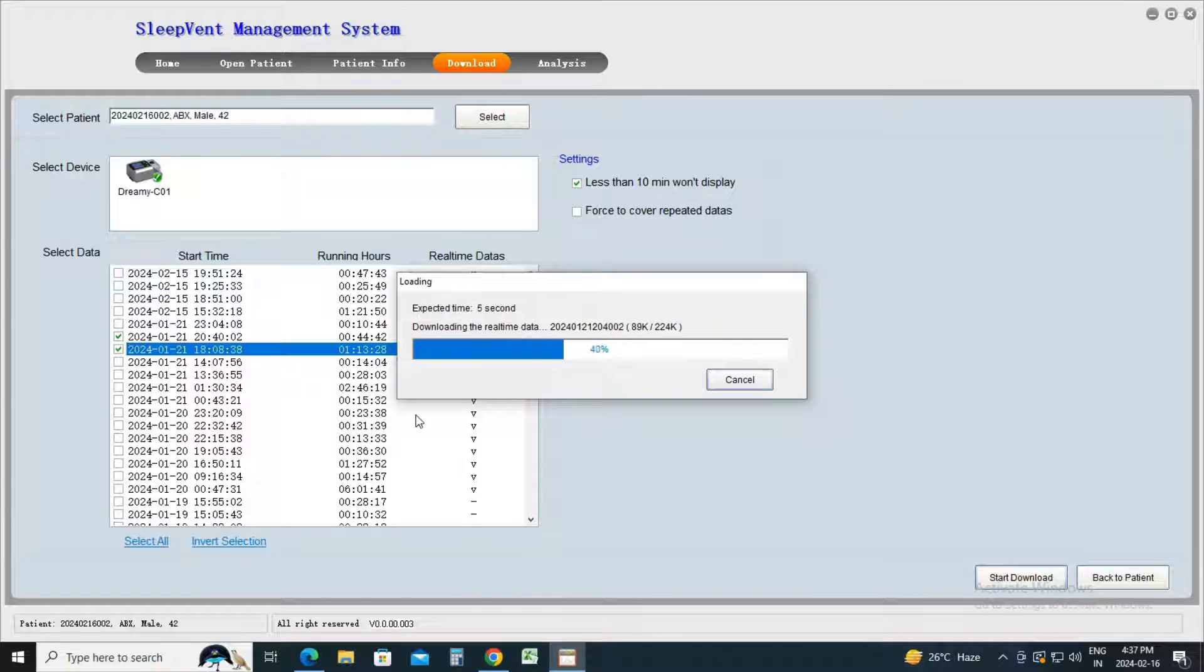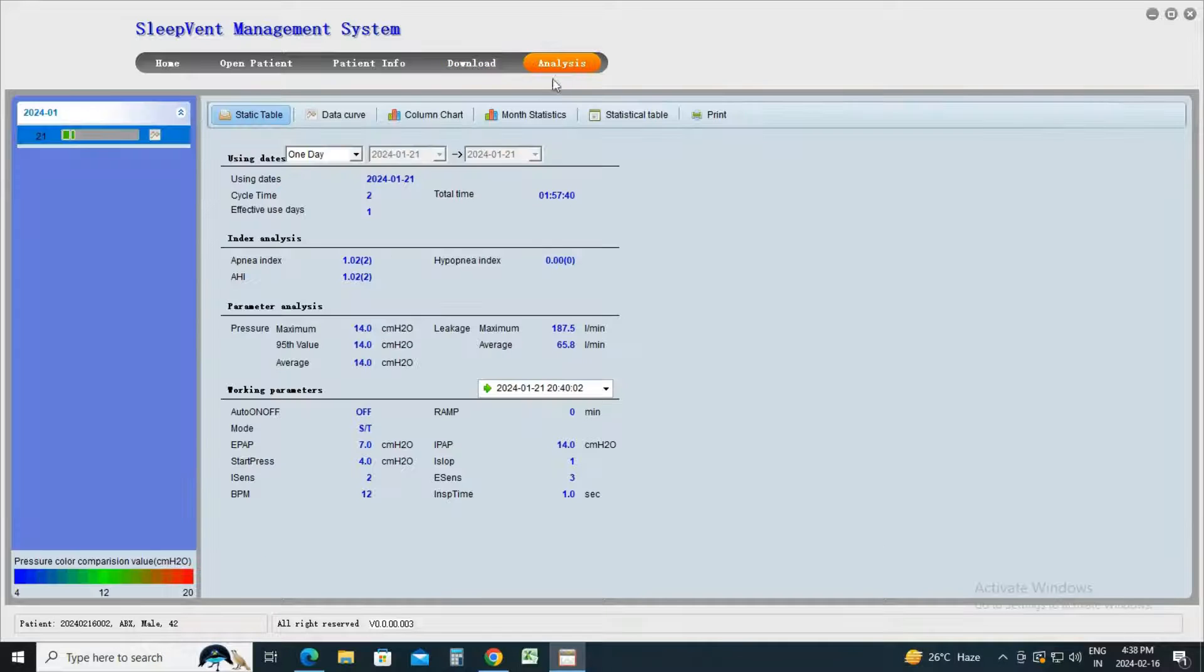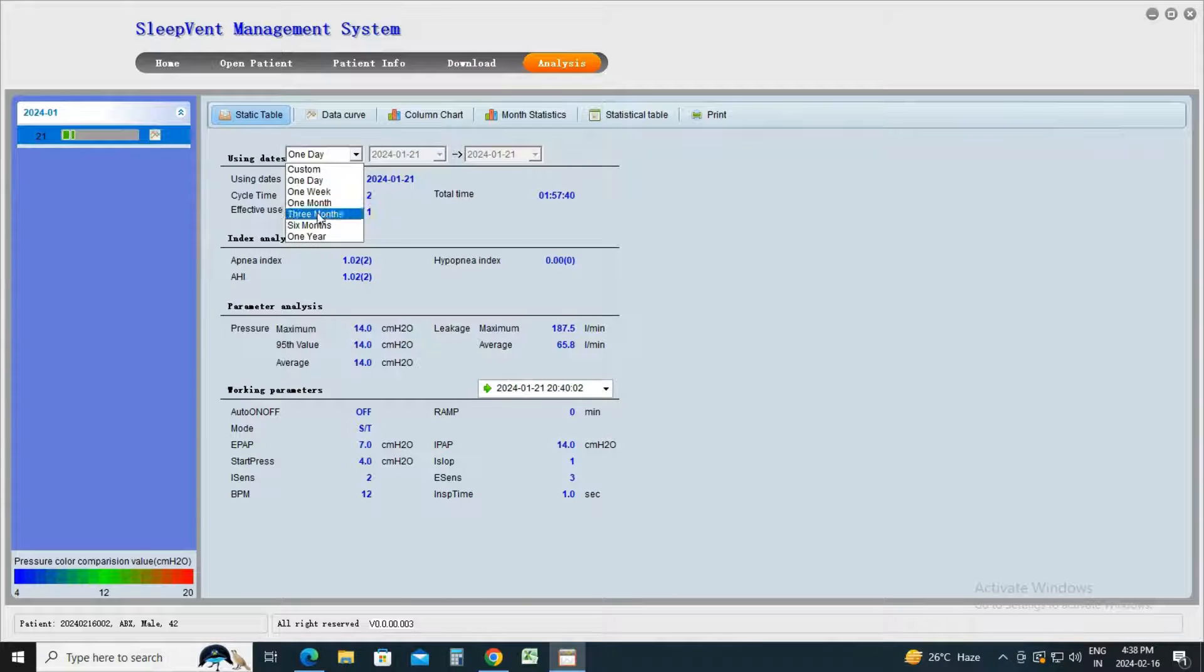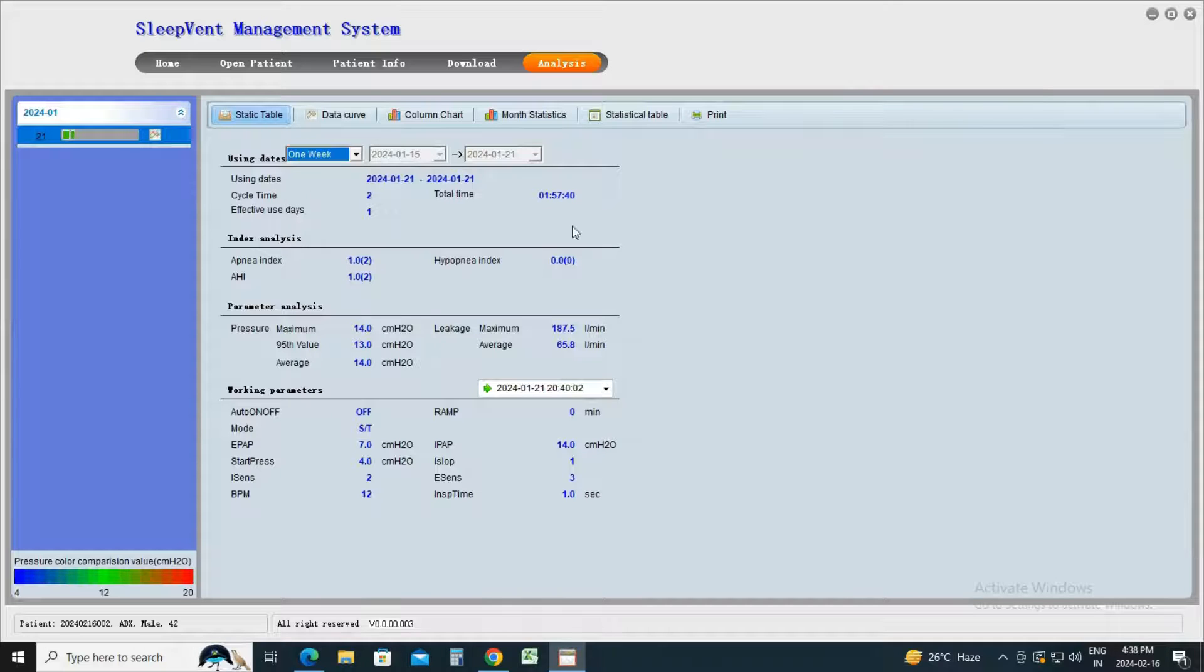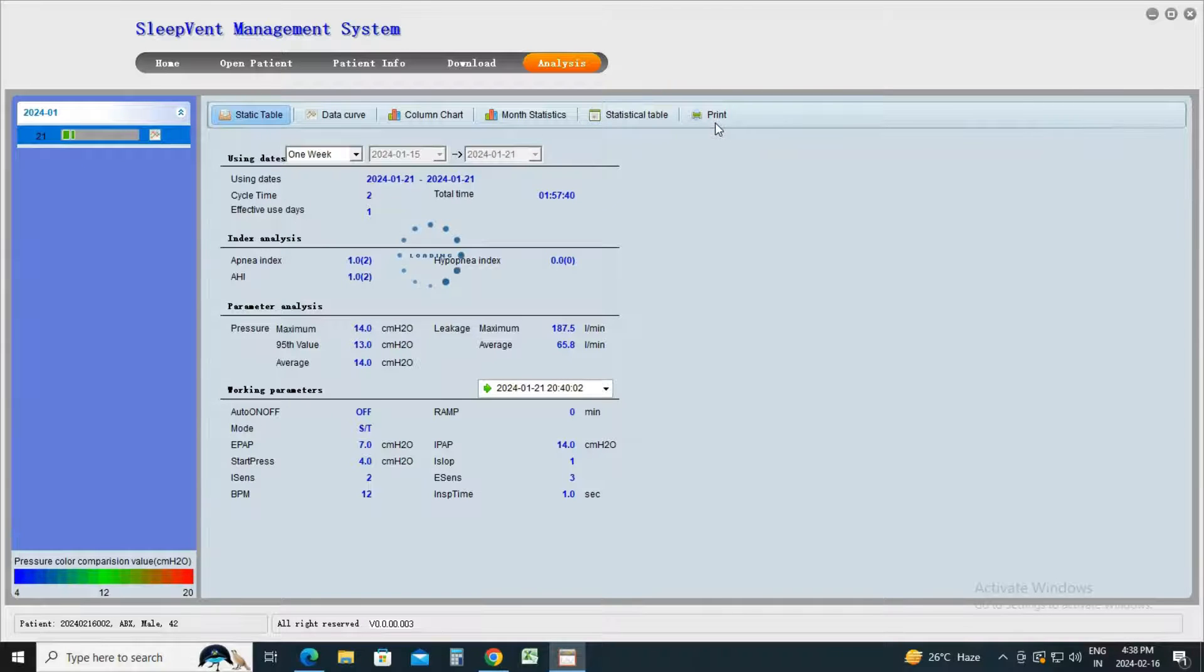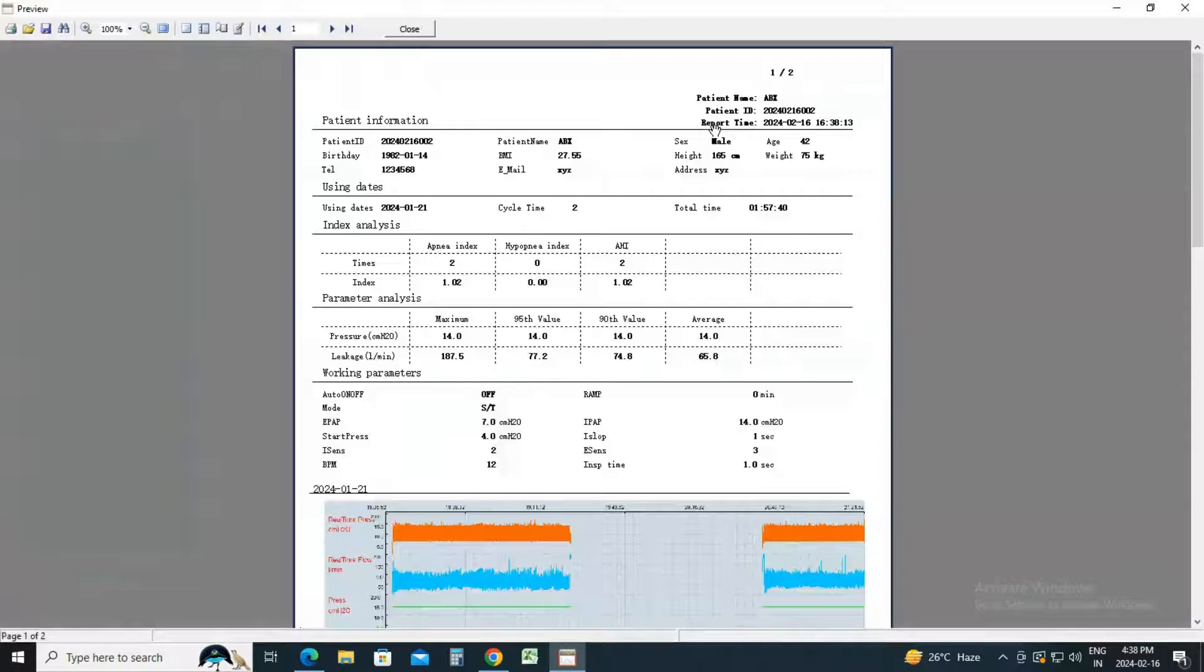Once the download is complete, go to the Analysis tab. Select the desired options under Using Dates: 1 day, 1 week, 1 month, or 3 months, according to your requirement. Click on the Print icon to generate and print the report.